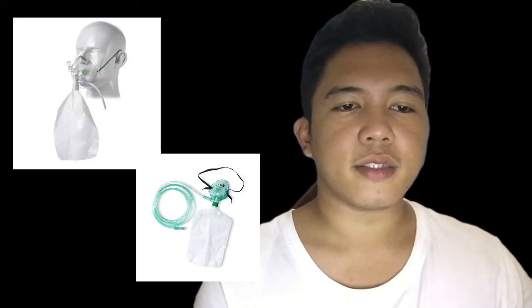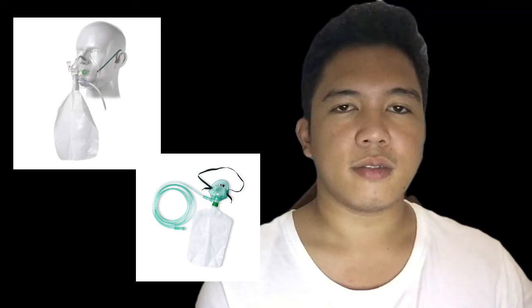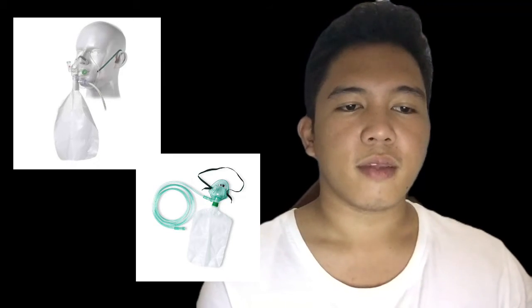The next is the non-rebreather mask. It is an effective method of delivering high concentrations of oxygen to a breathing patient. It is similar to the partial rebreathing mask, except it has a series of one-way valves.